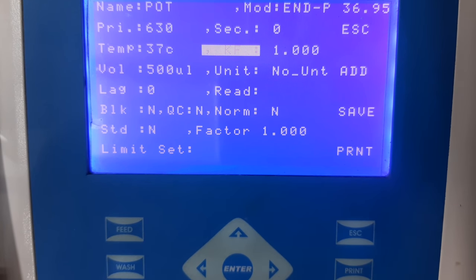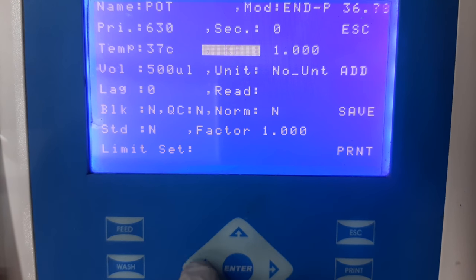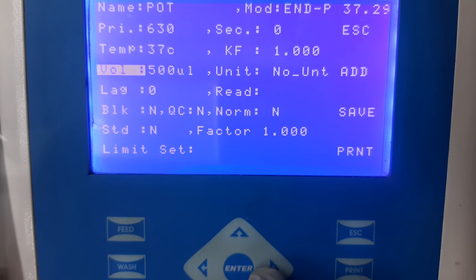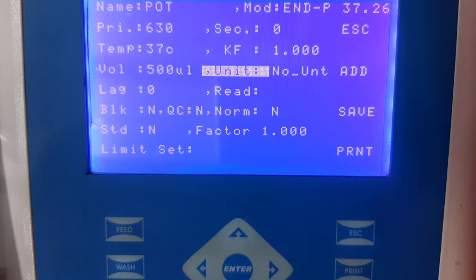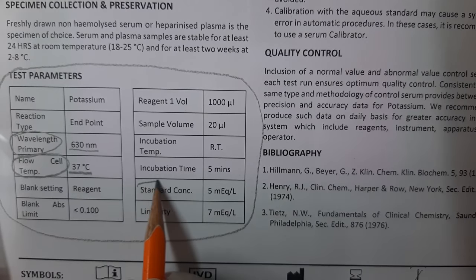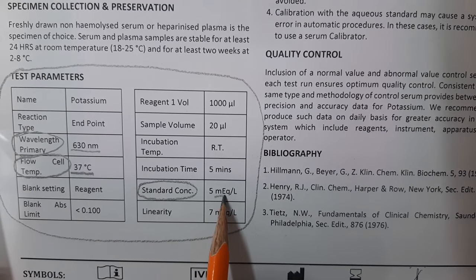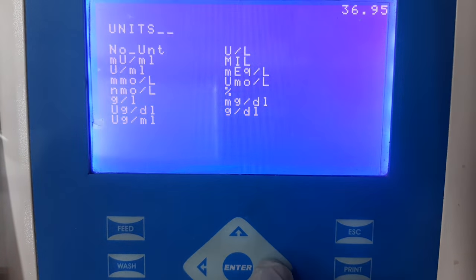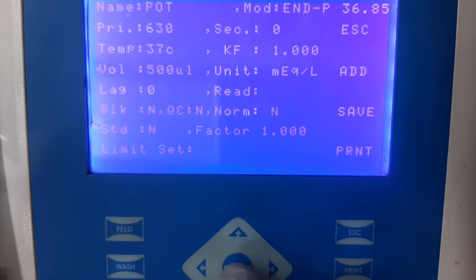The next information that needs to be added is KF or kinetic factor, which is to be maintained at 1.0. The next is aspiration volume, which can be maintained at 500 microliters, or if you are doing the entire test in 500 microliters, it can be reduced to 400 microliters. The next information is units. To check what unit to enter, refer to the unit mentioned in the standard concentration in the instructions for use — the same unit needs to be added to the software. Select the option of units and from the list, select the unit mentioned in the instructions for use.